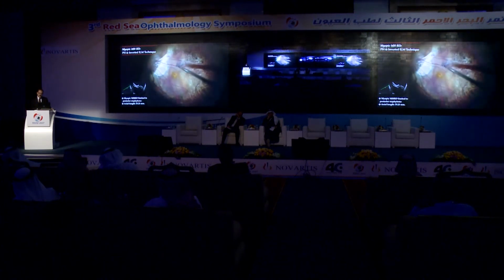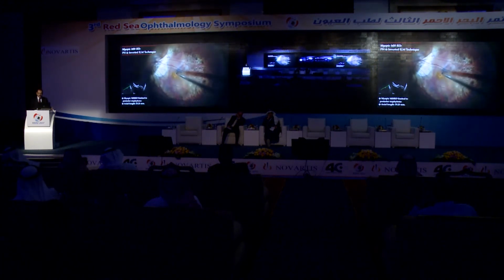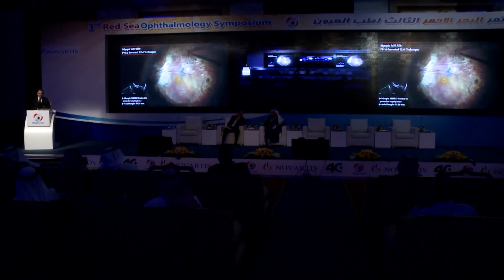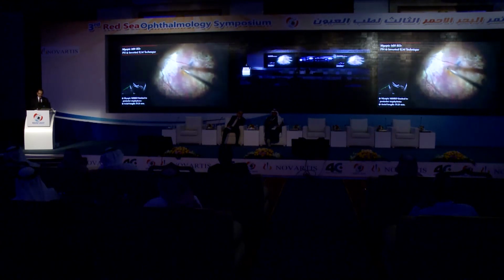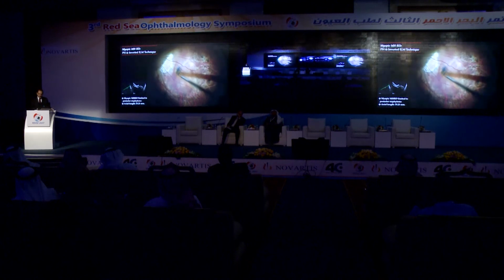Some may trim the flap at the edge of the macular hole, creating a small flap, but I don't care about trimming because I want to leave the internal limiting membrane over the macular hole under the air and stimulate the glial tissue proliferation in order to seal the macular hole.